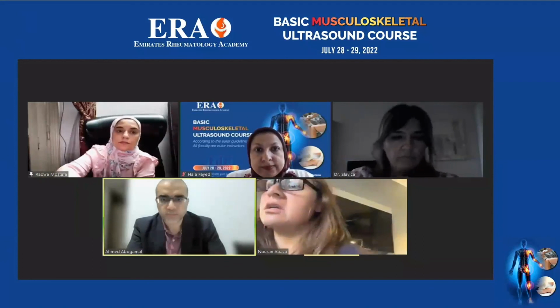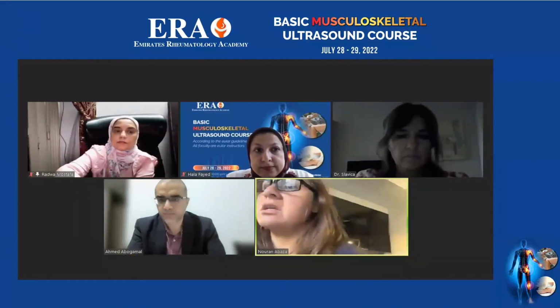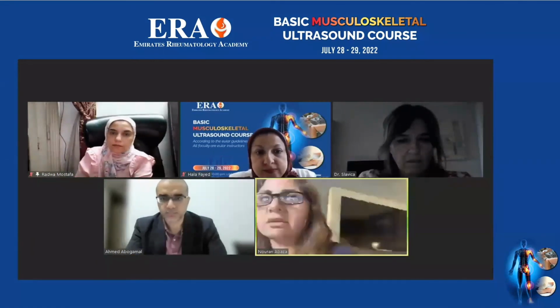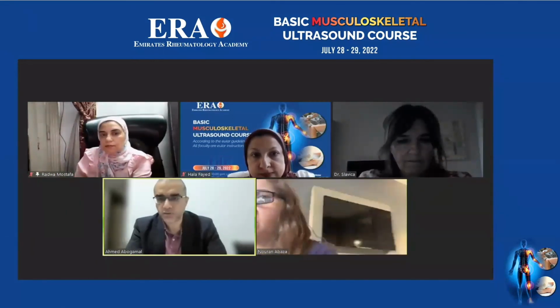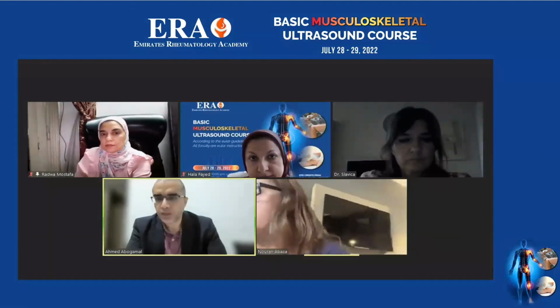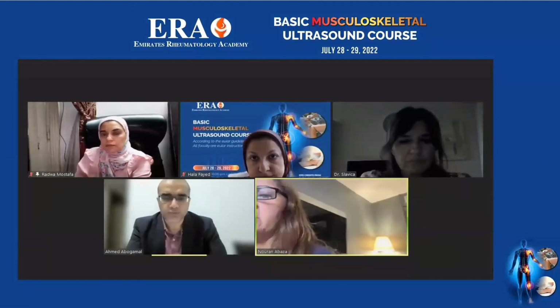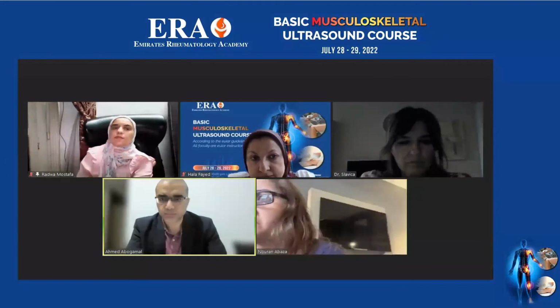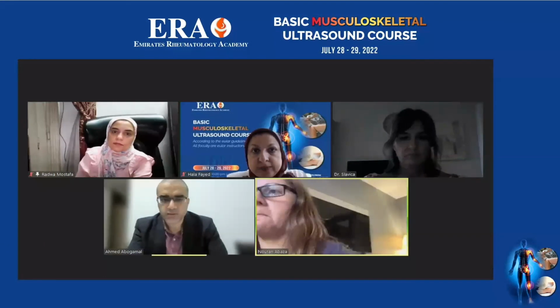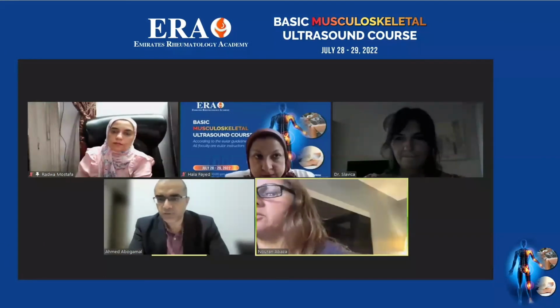Yes, I just unmuted. I'm sorry. I heard the question. I don't include the paratenon. Okay, so we're relying mainly on the tendon thickness itself, the pure tendon thickness, in the fibrillar pattern. Yes. This applies for all tendon measurements. Yes, thank you, Professor Abou-Gamal.